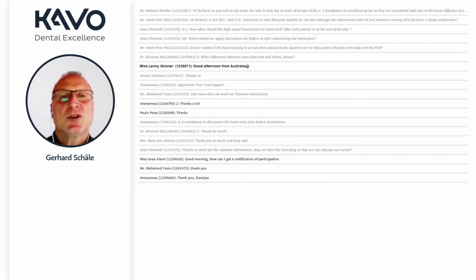How often do you sterilize? If you sterilize once a day, at the end of the day, you still have to spray it twice, lunchtime and evening, before the instrument goes into the sterilization. When you sterilize between each client, then you have to spray before you put it in the sterilizer. That means, just to give you an idea, if you sterilize 5 times a day, you have to spray it 5 times a day, before each sterilization.